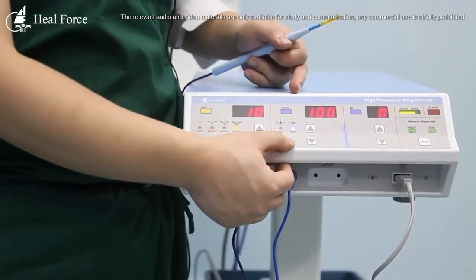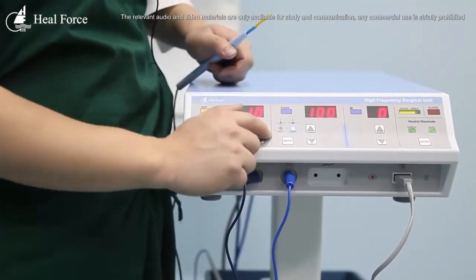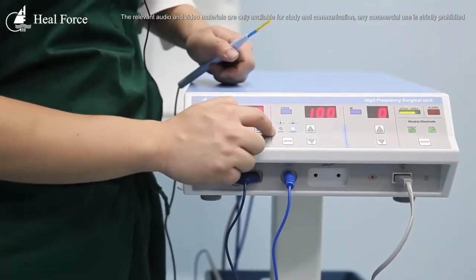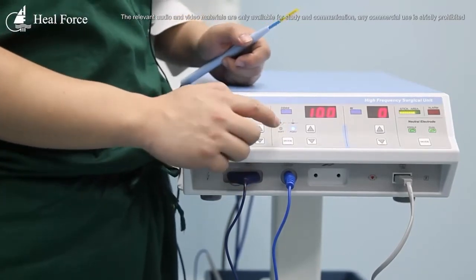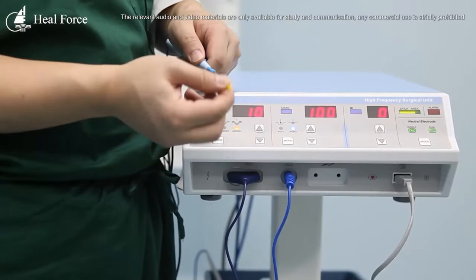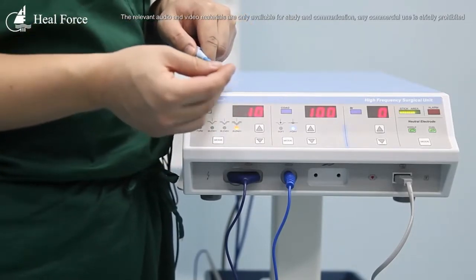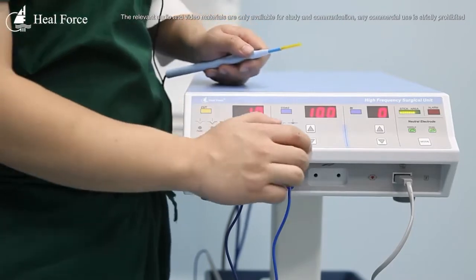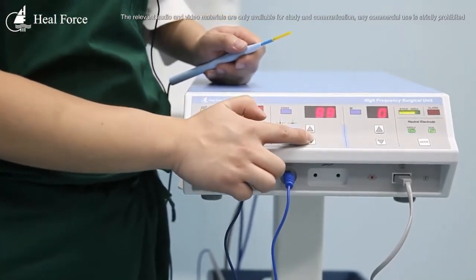In coagulation mode, we can change to soft point coagulation, soft coagulation, and point coagulation. Different displays are used for these modes, though we are not demonstrating them all today. The same method is used to adjust the output for bipolar mode.